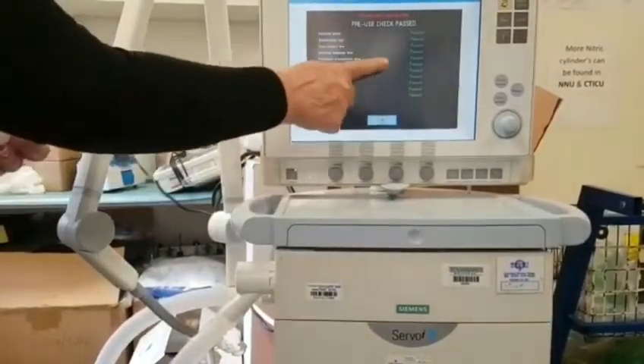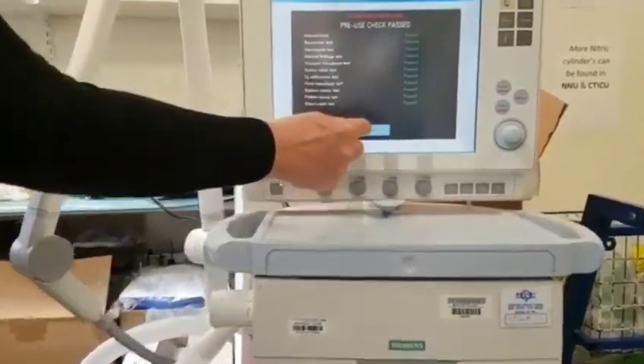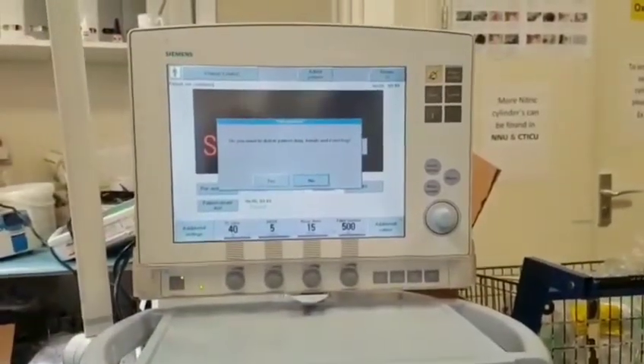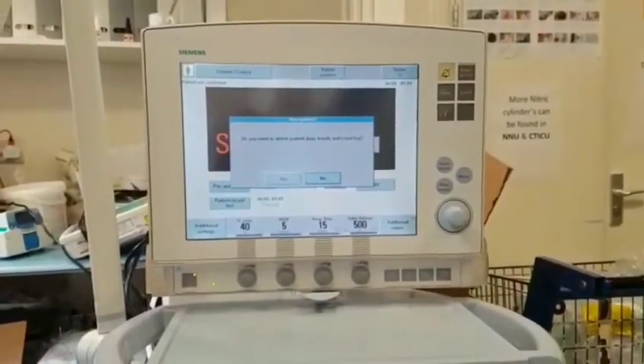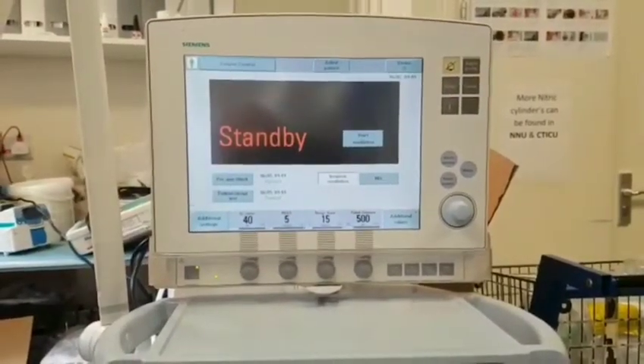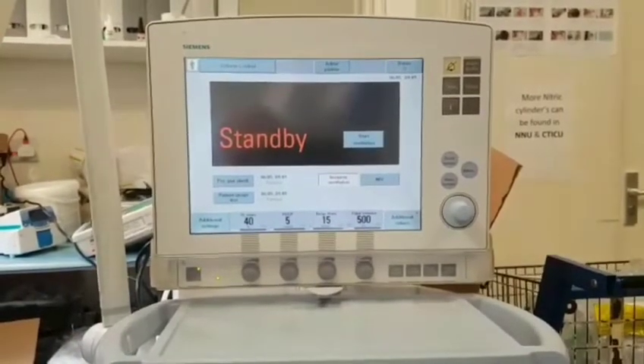Now all of the checks are passed and I can say OK to return to standby. Now it's asking me, do I want to delete the patient data trends and event log? New patient, so I'm going to say yes. And it brings me to my standby screen so I can start ventilating.